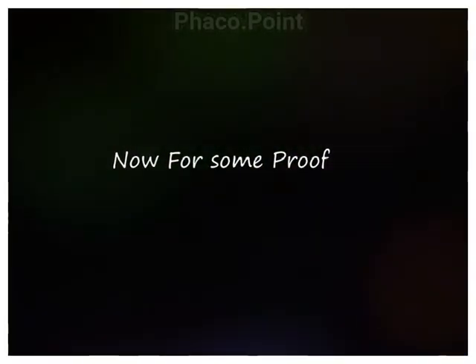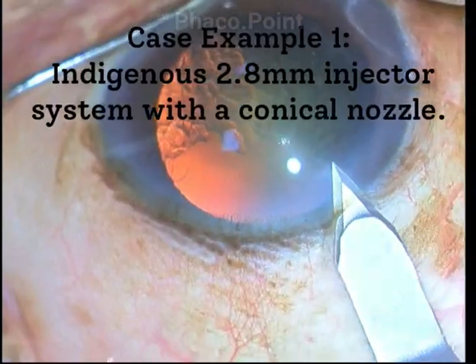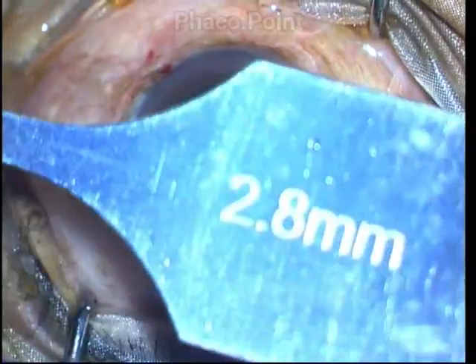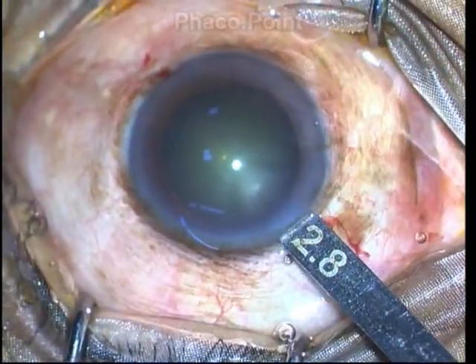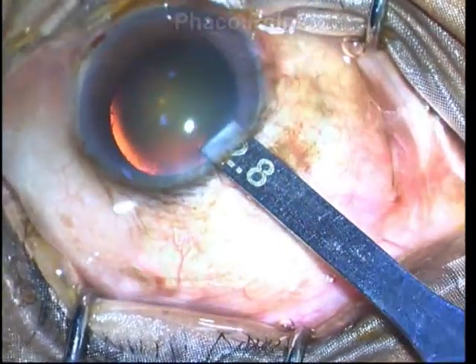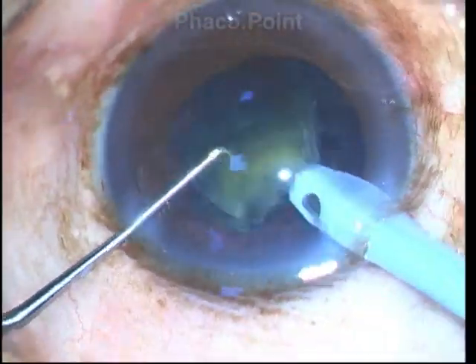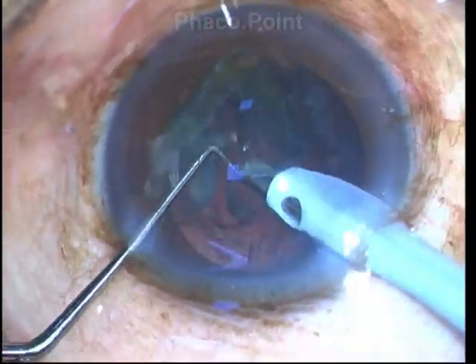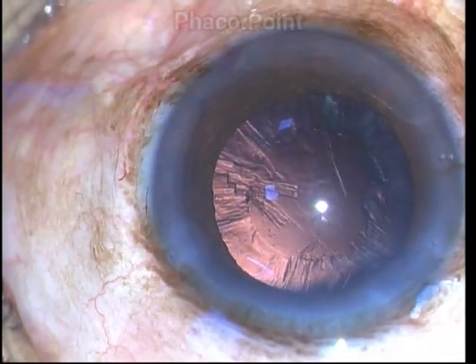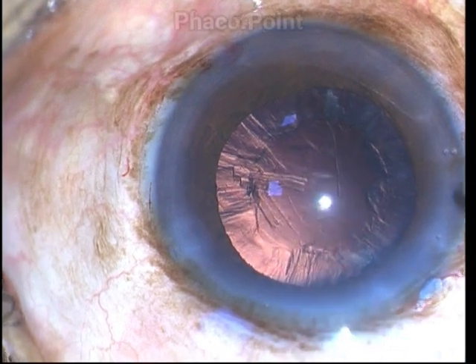So enough of didactics — let's see some proof of concept. In the first case example, I am fashioning a clear corneal incision, after which the size of the incision is measured using a special caliper, and we can see a very snug fit of the 2.8 mm caliper into this incision. I proceed with complete phacoemulsification, and at the end, when I pull out the phaco probe, the clear corneal incision is quite pristine with no evidence of wound gape or wound bleed.